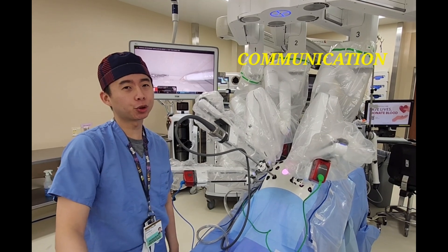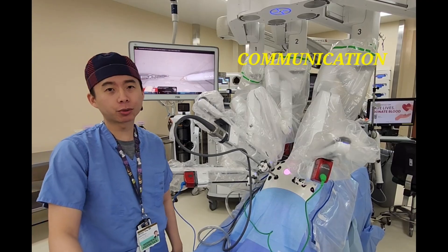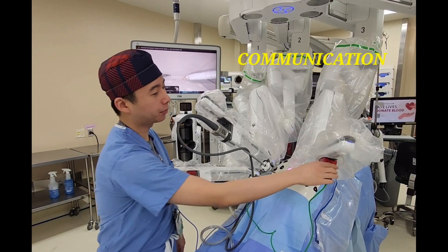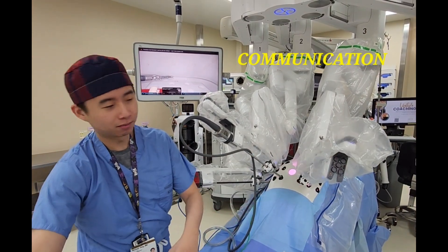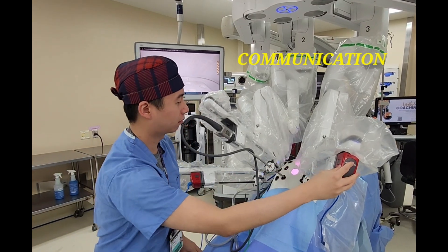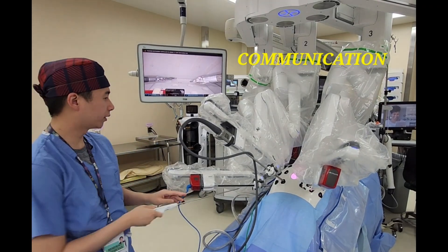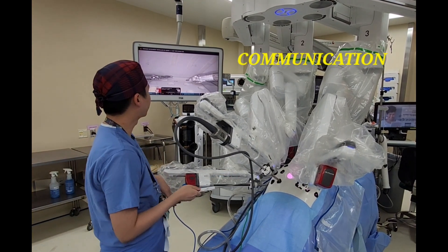Communication with your console surgeon is essential in robotic cases. Every time you insert or switch robotic instruments — passing them in and out — you need to let the console surgeon know. For example, you can say 'monopolar coming out, needle driver coming in,' and for passing needles, 'needle coming in' and 'needle coming out.'